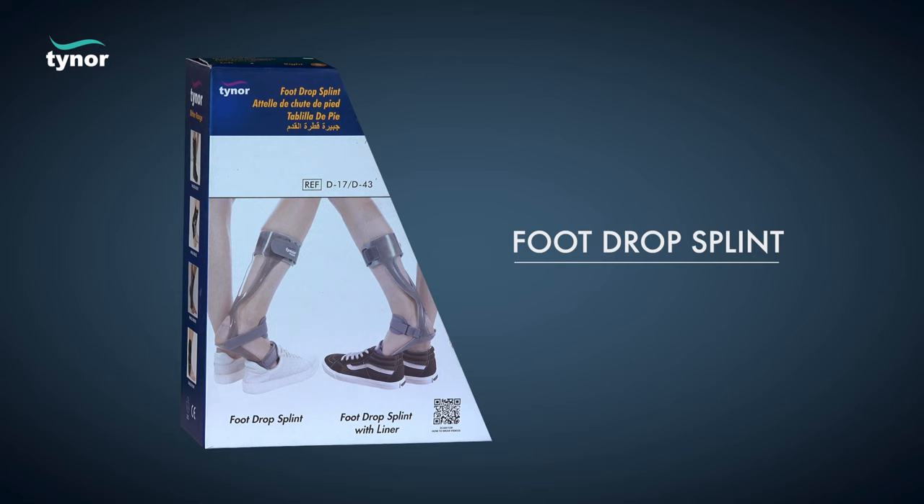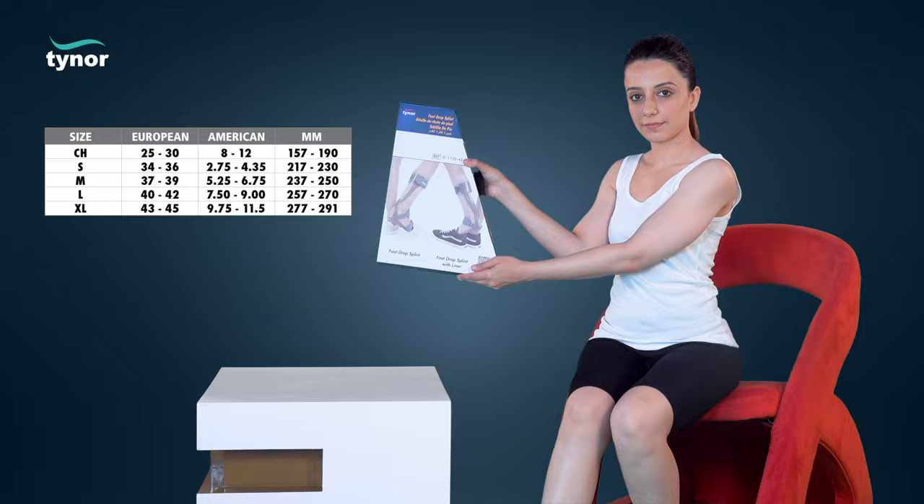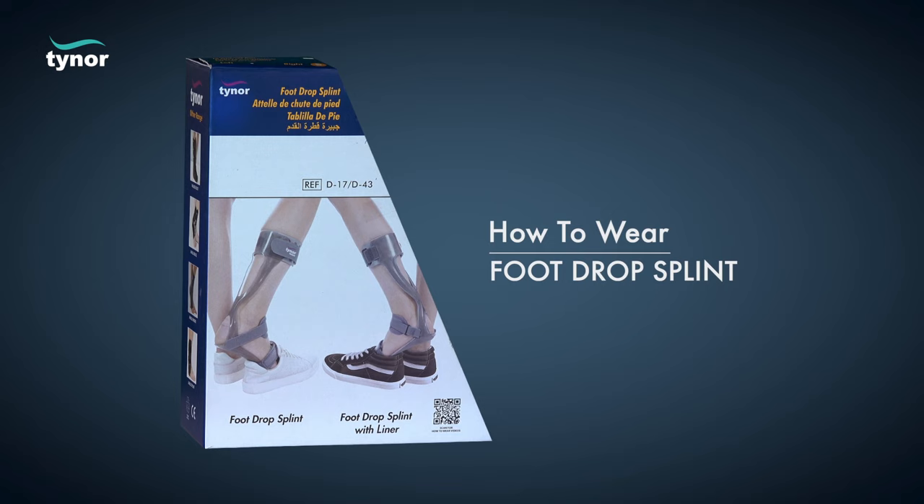Here we will discuss how to measure the size and how to wear the foot drop splint. The foot drop splint is available in these sizes. Measure the shoe size. Now let us see how to wear the foot drop splint.